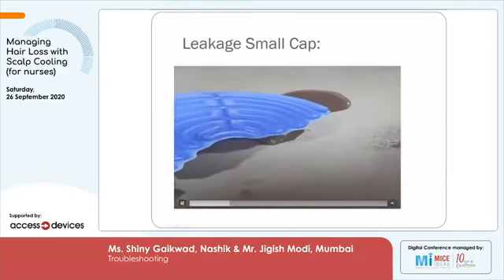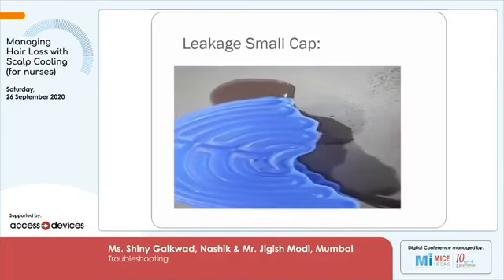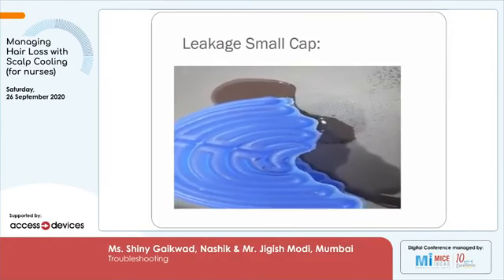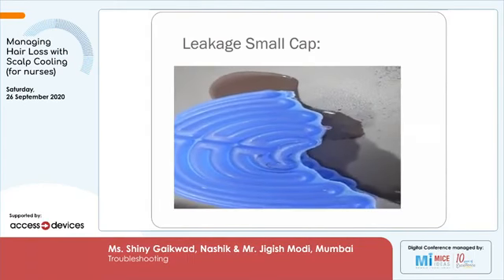You can see that if the rivet goes and hits the cap, there is a small shower which comes out and you can see the cap leaking continuously. We do not want this kind of situation to arise. That is why we put gauze pieces between the rivets and the silicon caps.